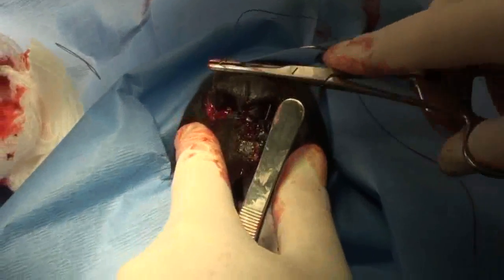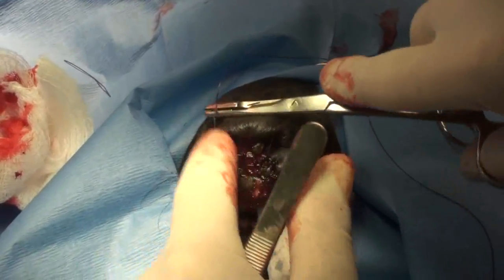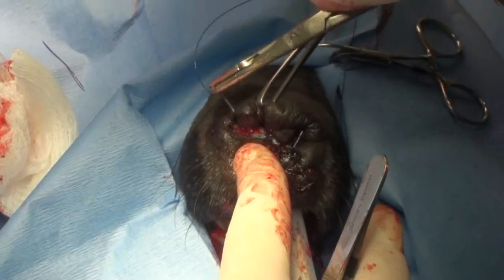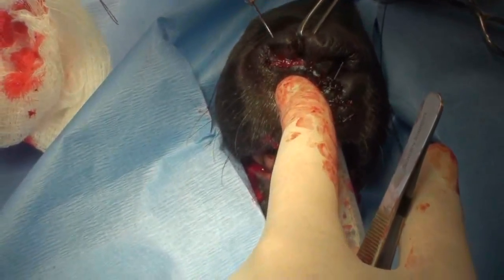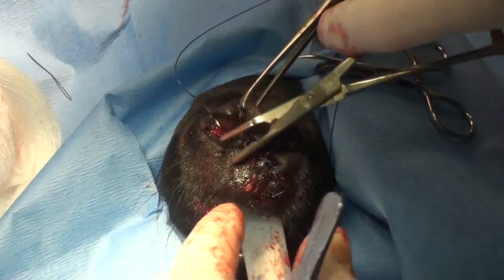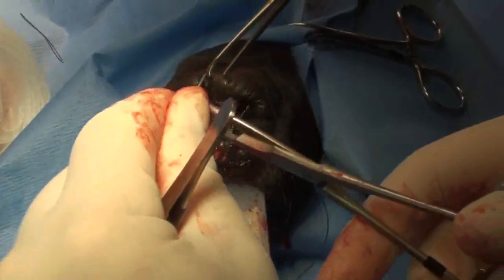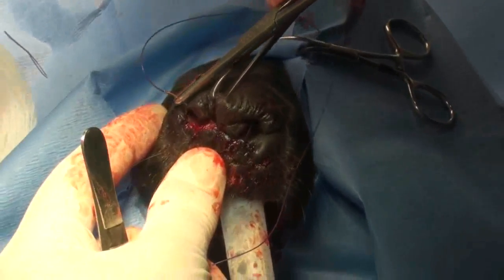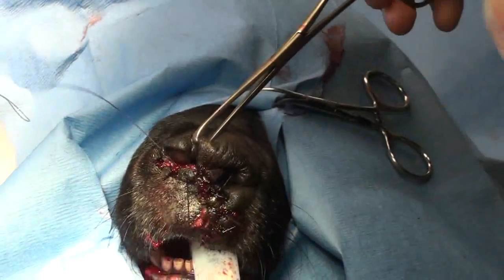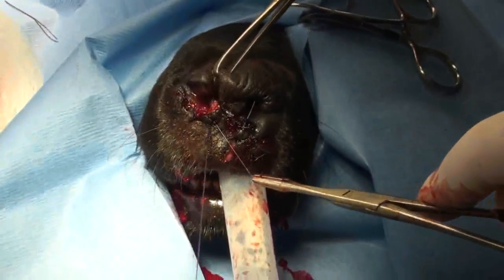Now I'm going under the nose in there, because we don't want to sew the nose shut — we can't sew that to that. So now I'm getting the nostril out of the way and I'm going to try to get down here and get this sewed up. I'm going into the cut, inside the nostril, and down below. Now I'm going to finish it up by going inside the nostril and outside — see how tough that is to get through? That's dog's skin in this area. So I'm going to finish this up by just closing that like that.